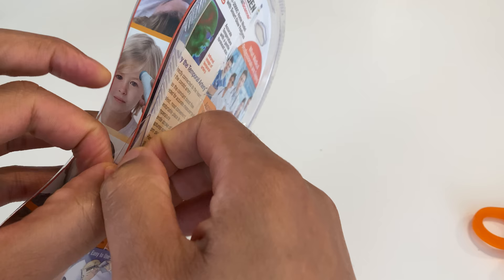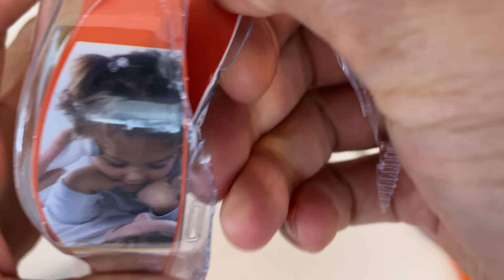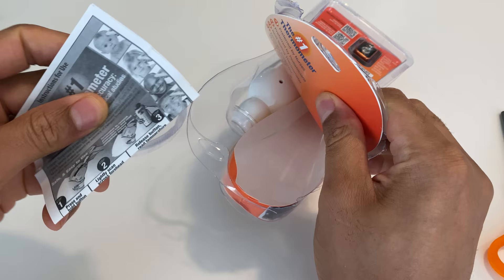The package is very difficult to open, so I'm going to go ahead and use a pair of scissors to cut the top of it. It doesn't want to open up too well, so I'm just going to cut the top with scissors — I don't want to hurt myself.